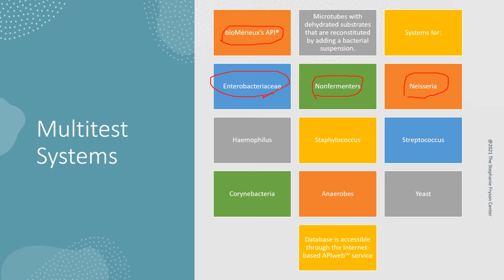The good thing about this system is that there's a web-based database, so you can always find answers in the middle of the night. If you're not really sure how to interpret it, you can go online and find answers to help you with interpreting the system.